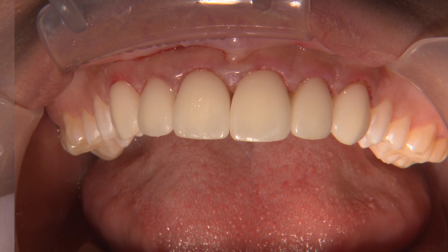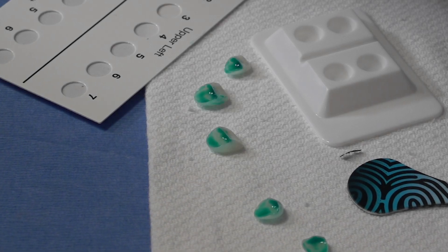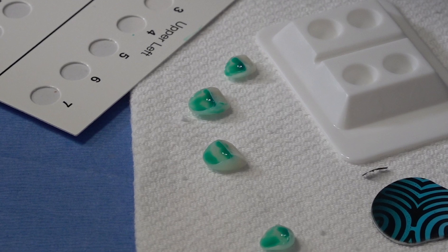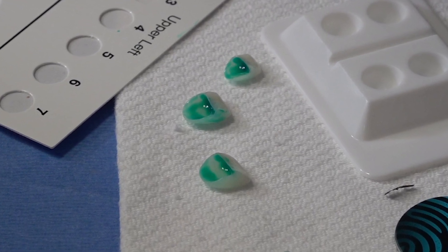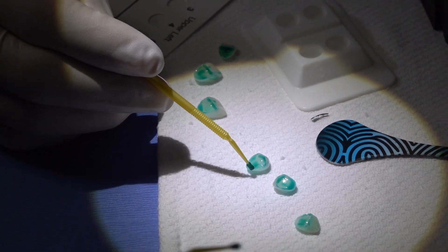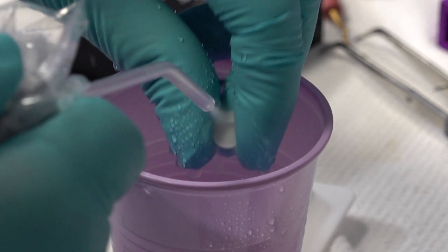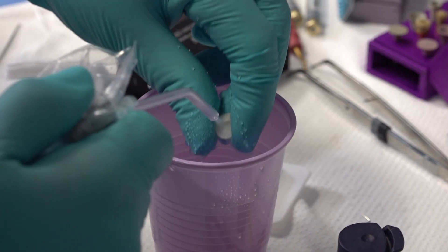Once everything checks off, we'll proceed with preparing the restorations for bonding. Here we're using a product from Avaclar called Monobon Etchin Prime, which is a single component ceramic primer that etches and silanates glass ceramics in one step. It's scrubbed in and allowed to react for 60 seconds where the ammonium polyfluoride etches the ceramic, and after rinsing the solution away, a silane layer remains. Pretty cool stuff.